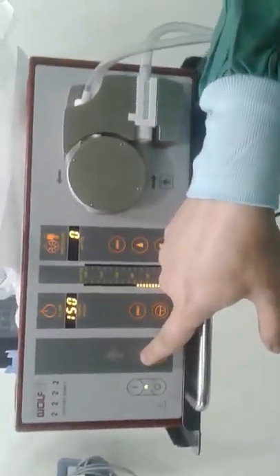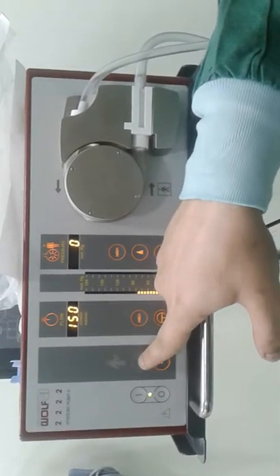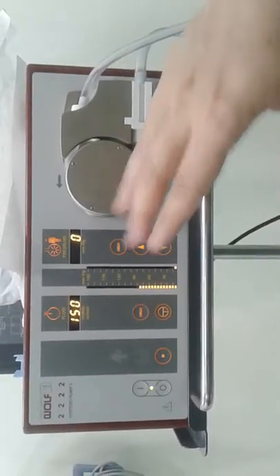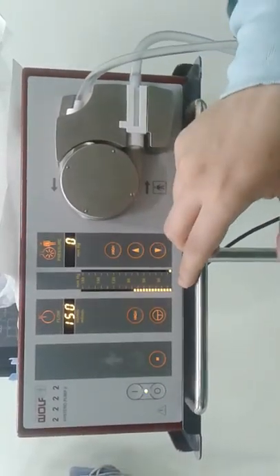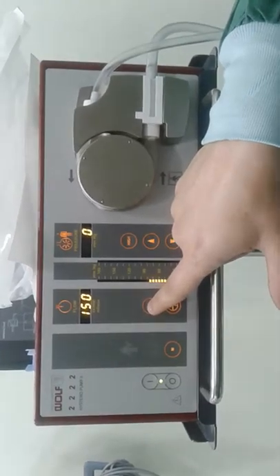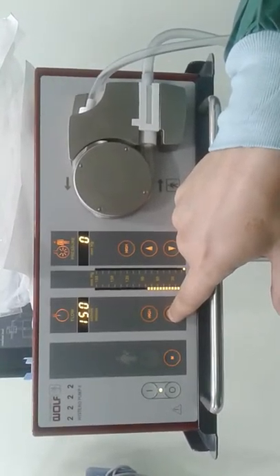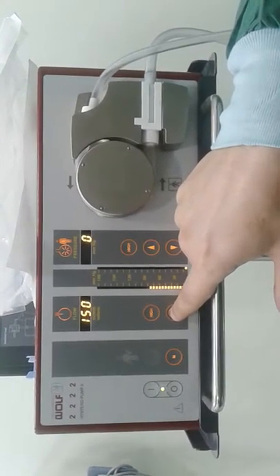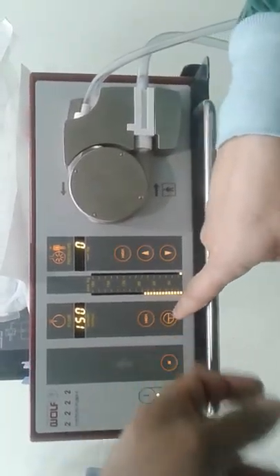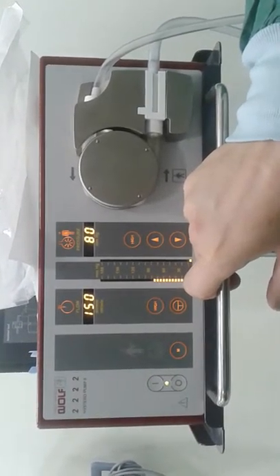This, if it lights red, means that there is overpressure inside the uterus. You must reduce the pressure or turn off the device. It's very dangerous. This is for the high flow mode. This is the start and stop button, to start the flow. Stop.